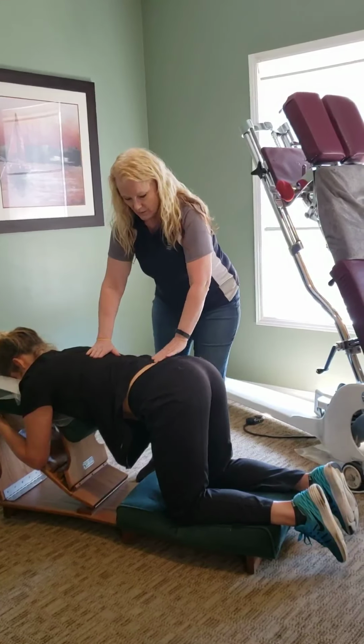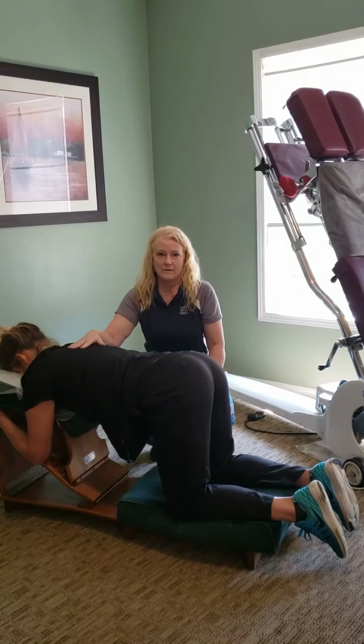Great, so now we get her in the position that we need her. And remember, when you were setting your patient up, with the top 3 thoracics and the base of that sacrum to be level, looking at your patient from the side to determine that. Never come behind your patient like this and say, well, that looks pretty good, okay? Not appropriate at all, okay? So just being careful of what you say to your patient when they're on the table and how you care for them, because your confidence with this table will instill confidence in your patient.